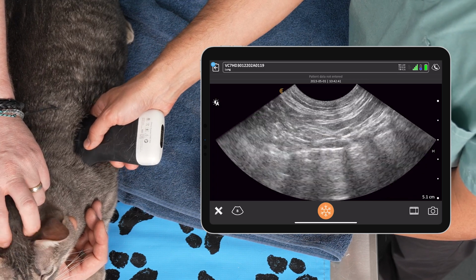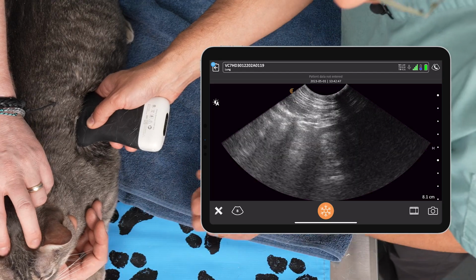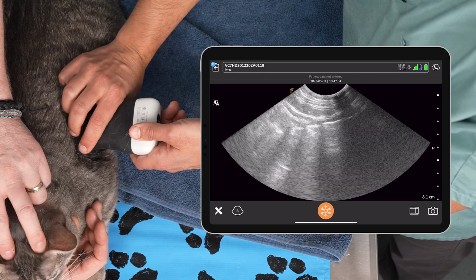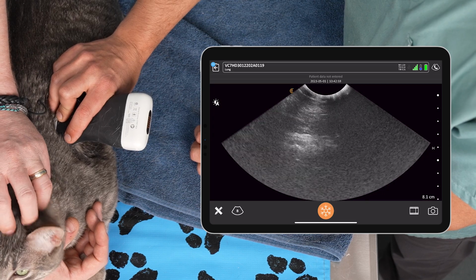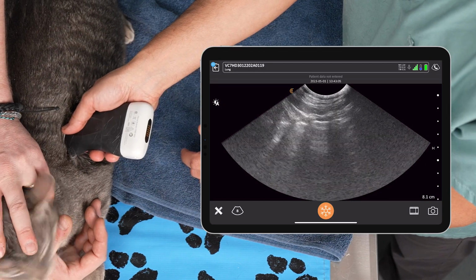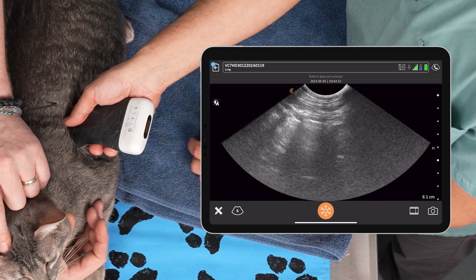So now I'm going to start sliding back until we see that curtain sign, and there it is right there. I'm going to increase our depth there, so we'll make sure we're over it, and increase our gain there. So now I went cranial border, caudal border, and now I'm going to go all the way to her caudal dorsal border. Boom. I've lost that pleural line in the hypaxial muscles, our dorsal border. We're going to come back down, and like we did with the pneumothorax, we're going to see if we have a glide sign here. We can see the curtain sign there. We have a glide sign. I'm at the highest point of the chest. Now I am ready to go border to border to border.